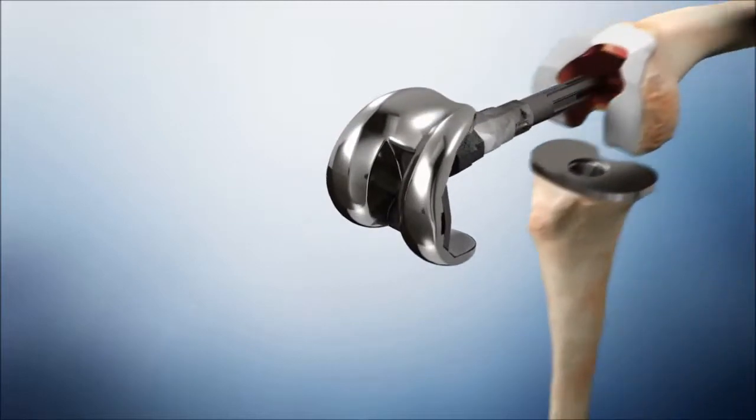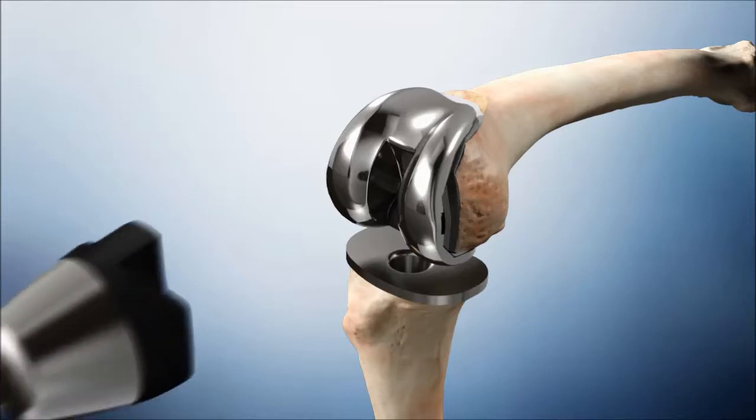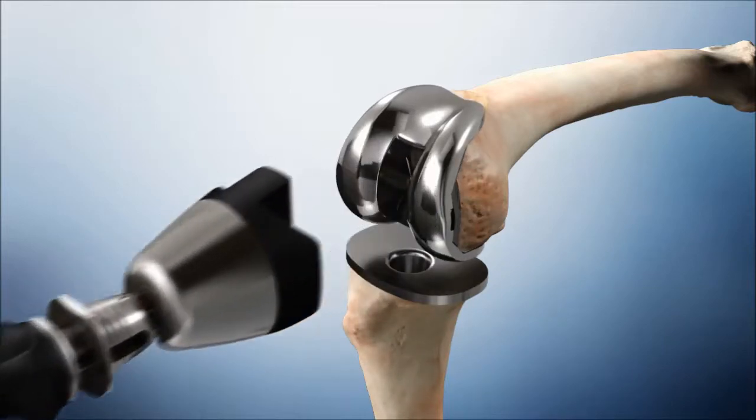Apply bone cement to the posterior condyles of the femoral component prior to introducing to the prepared femur. Bone cement should be applied to the prepared femoral bone surfaces, including the anterior chamfer, distal and posterior chamfer, prior to introducing the final implant. Implant the femoral component using the femoral impactor.